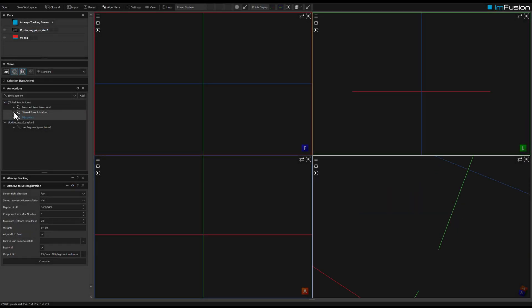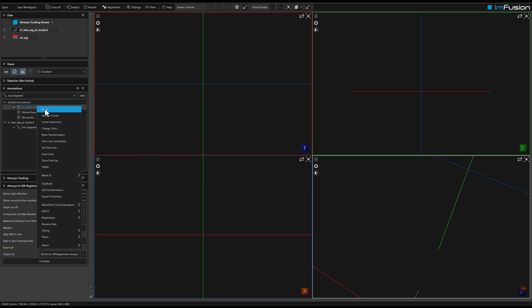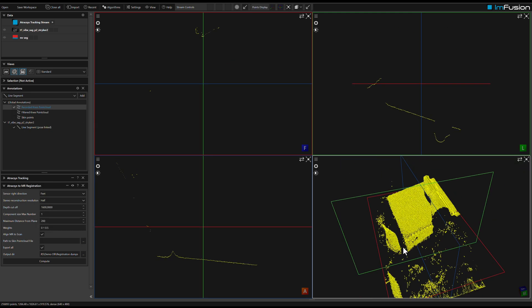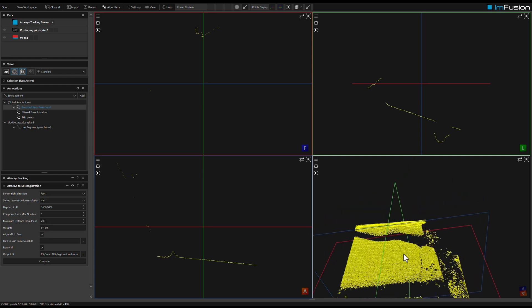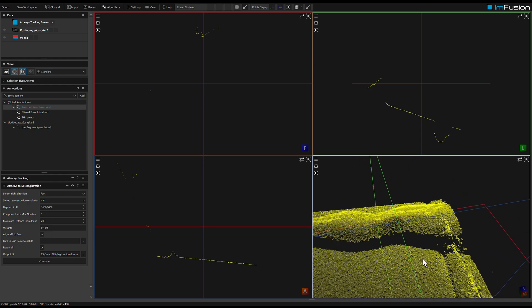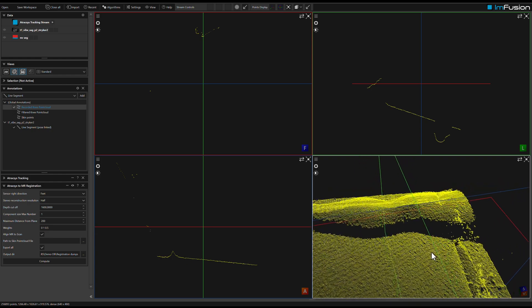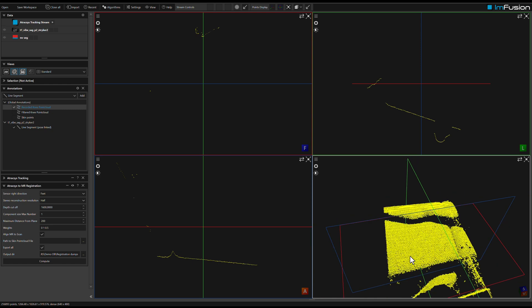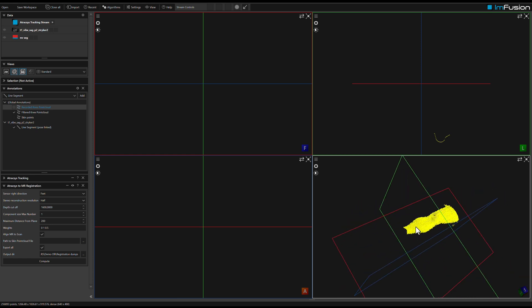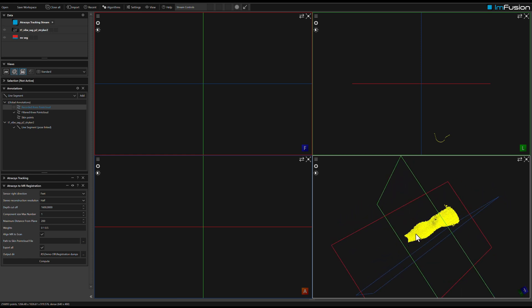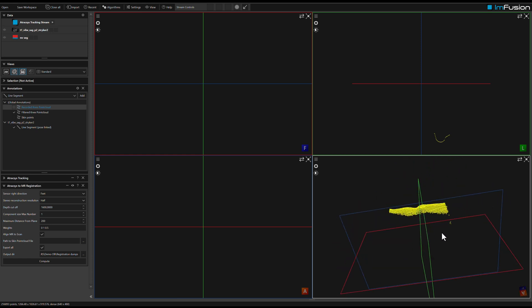Let's first have a look at the input 3D scan. Here you can see the original 3D scan provided by the sensor. For our demo we automatically detect the patient bed surface and use it to remove all unrelated parts of the scan.